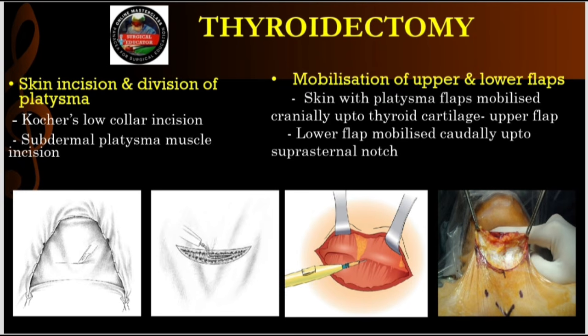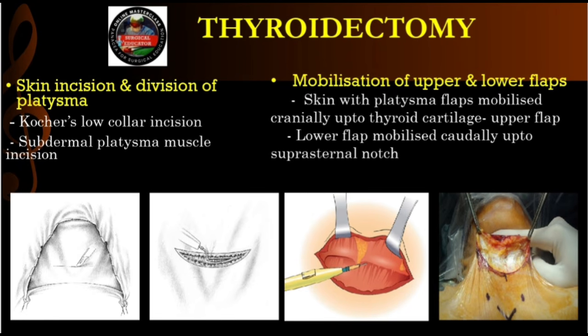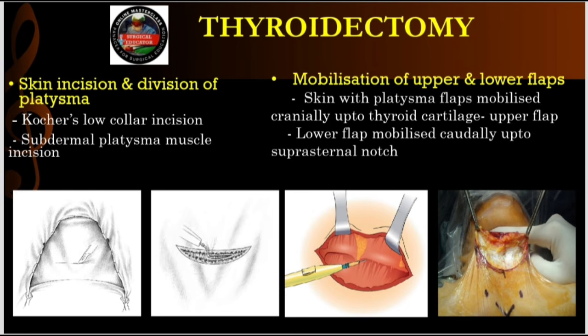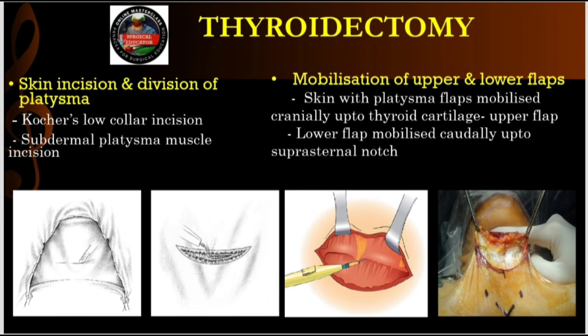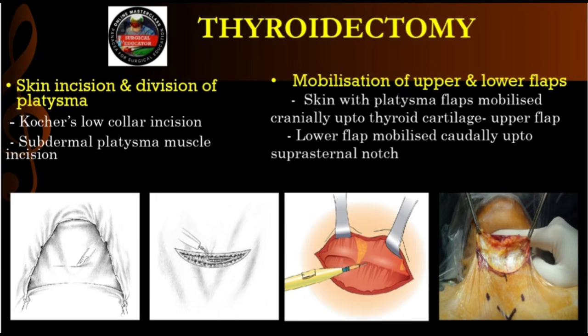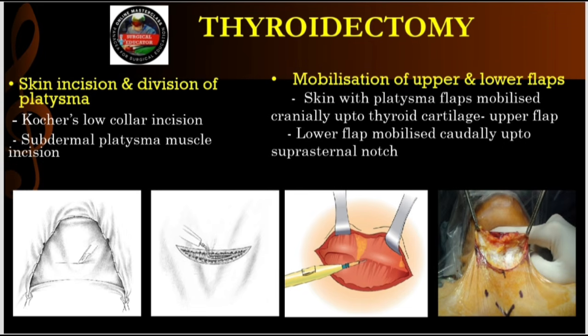Okay, so we make the Kocher incision through the skin fat, and then we hit the platysma muscle. The slide says divide the subdermal platysma in the same line. Right. The platysma is fascinating. It doesn't connect bone to bone. It's an evolutionary leftover, basically. Like the muscle horses use to twitch flies off their skin. Exactly, the paniculus carnosus. In humans, it's just this paper-thin, fibrous sheet covering the front of the neck. But surgically, it's the roof of our operative space.